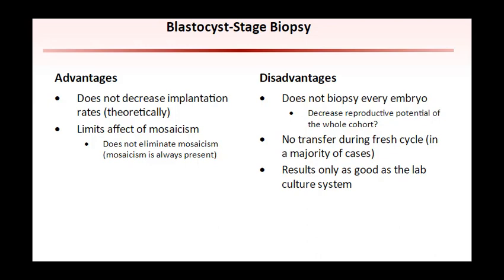Lastly, because only blastocysts are biopsied, the results of this approach are only as good as the laboratory's culture system. Low oxygen, type of culture media, and type of incubator may all affect blastocyst development. If a lab has a low blastocyst formation rate, blastocyst biopsy may not be a beneficial option.